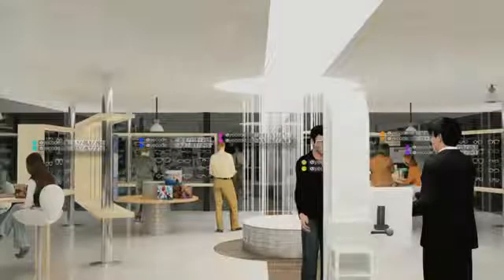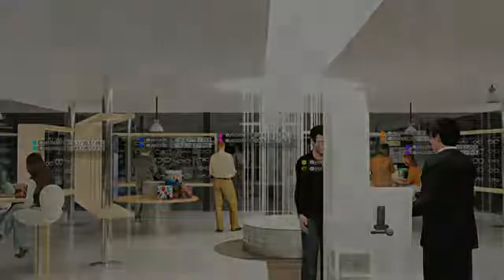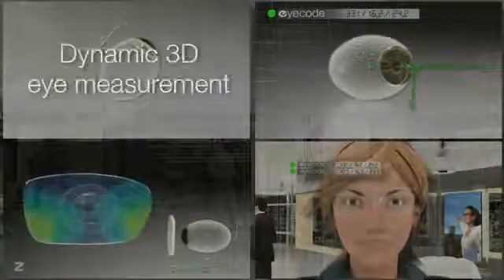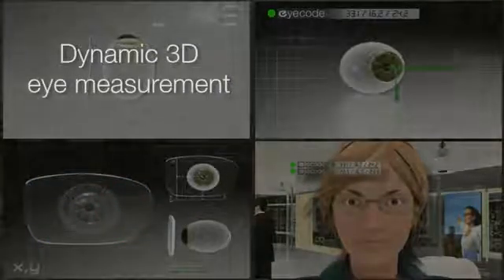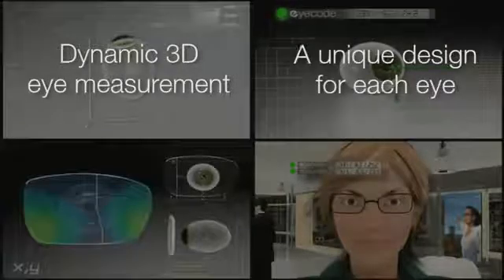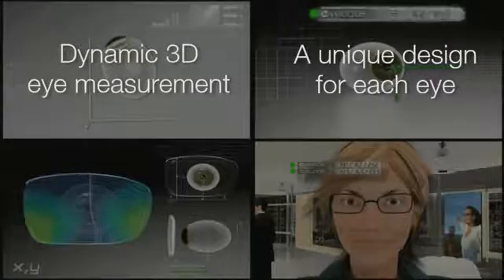By using Essilor's patented measuring device, you can perform dynamic 3D eye measurements and provide each patient's eye code right in your practice. With eye code, the patient receives a unique, perfect lens every time.